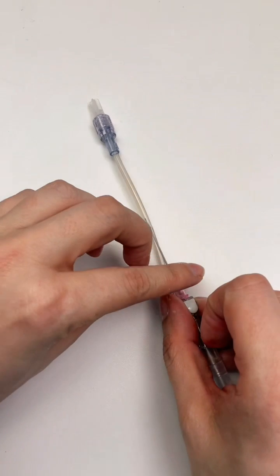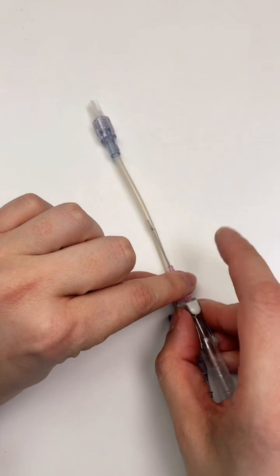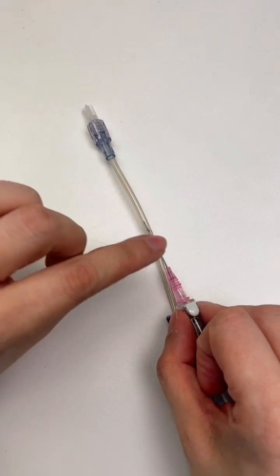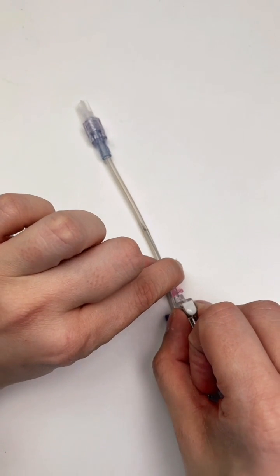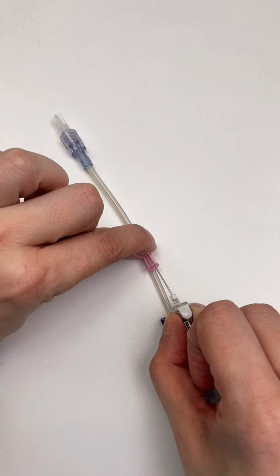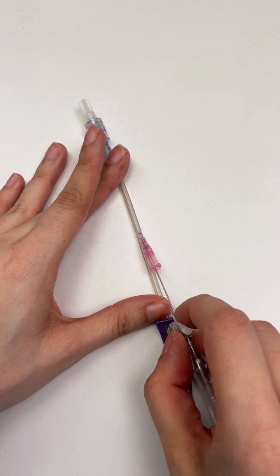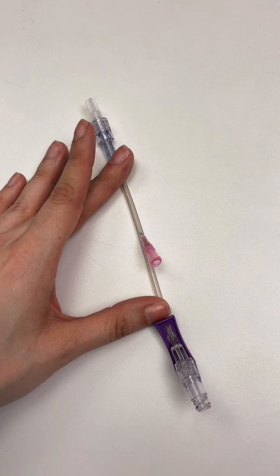With this two-handed advancement technique, you're going to use your dominant hand to hold steady the needle or the stylet, being careful not to push that safety button, and then you're going to use your other hand to advance the catheter into the vein. At that point you may then retract the needle and deploy the safety mechanism.